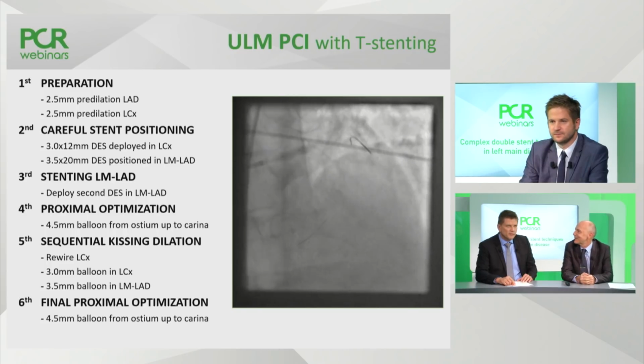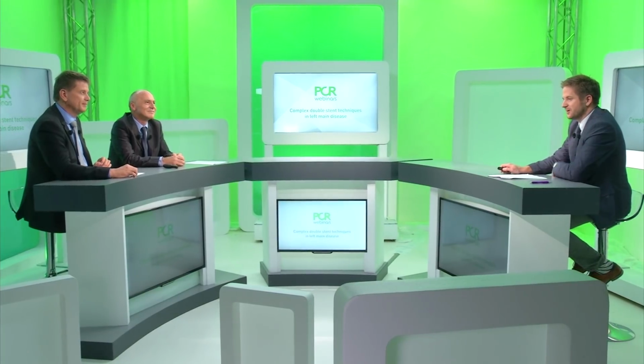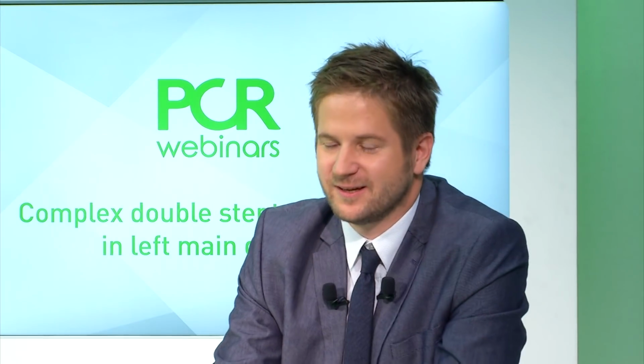Yeah, the most important thing in doing the final part, if you decide to do it, is that you have to do it correctly. Because if you push it too deep, you destroy everything you did before. So be careful if you do it. If you feel it's better, the stent is round, that is good. It's a good idea, but do it correctly. It's very important.